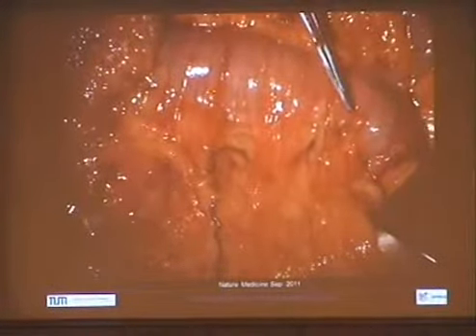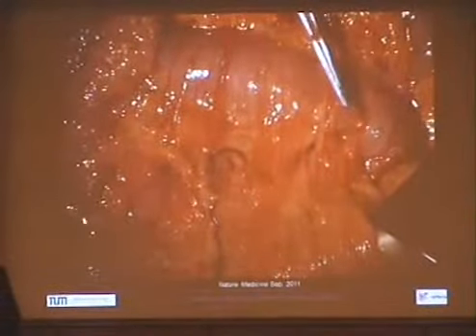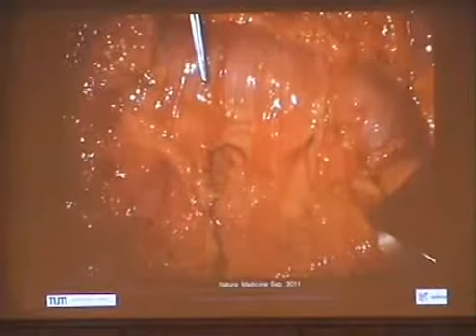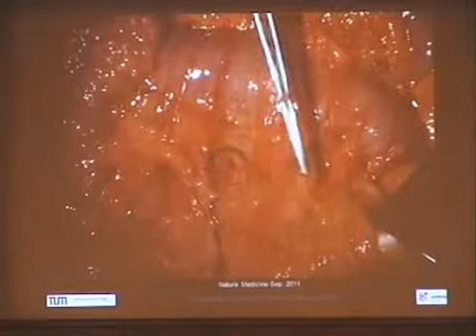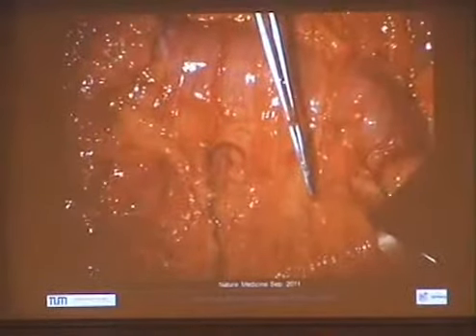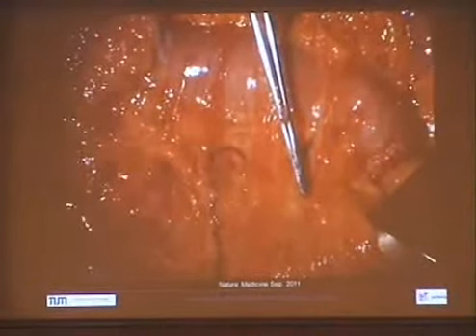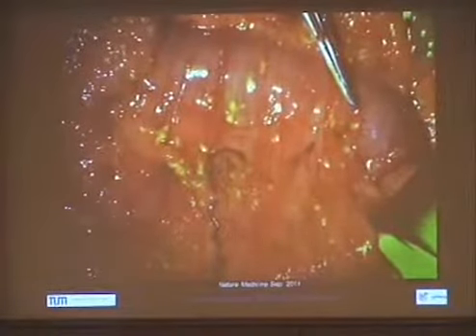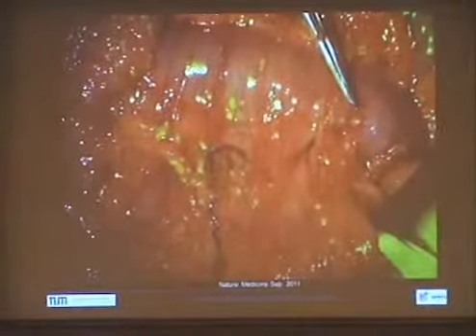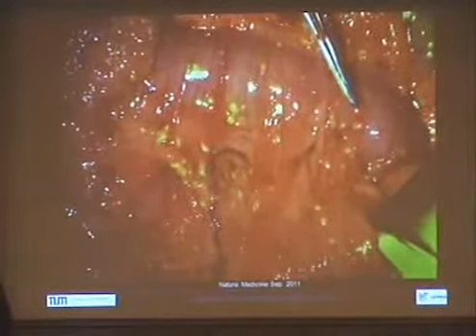Experienced surgeons will start seeing a lot of nodules. But the question is, how many nodules can you see? And this is not the question of how good of a surgeon you are. It's a question of how good the human eye is in detecting under the surface and detecting very small cells. It has nothing to do with the experience. It has to do with the capacity of the detector that you're using during surgery, which is the eye. So this is how the same view looks under the combined imaging with fluorescence. That was a very distributed disease, not a very good case. But you start seeing very small spots. You're seeing things that you maybe would have missed with the human eye.